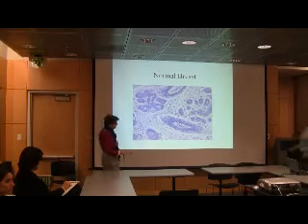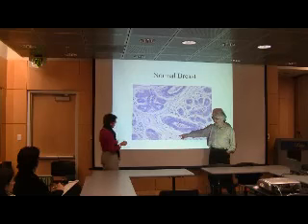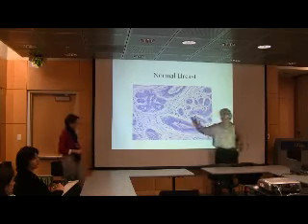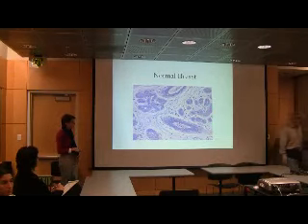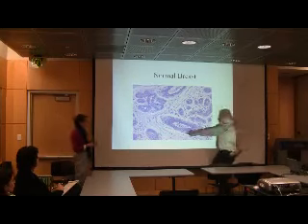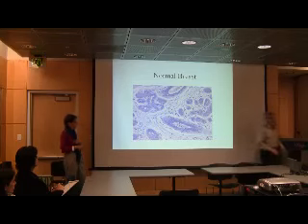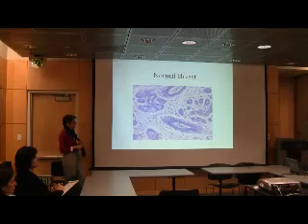So what else? What's this stuff in here? What's this pink stuff? Does everybody know? Actually, no. Collagen. So that's the material that is laid down sort of by fibroblasts, collagenous fibrils, right? So that's sort of what it looks like when it's cut in this two-dimensional structure.